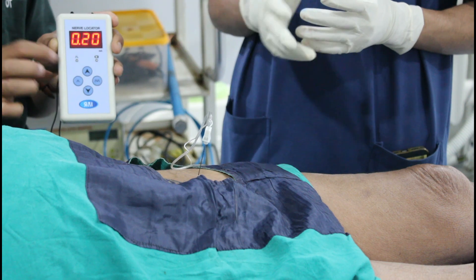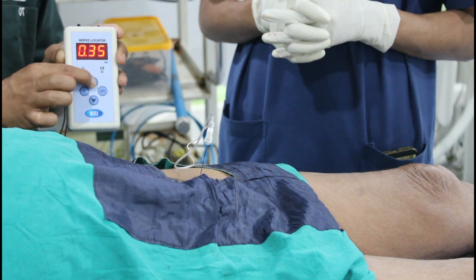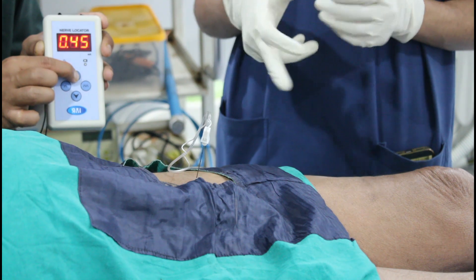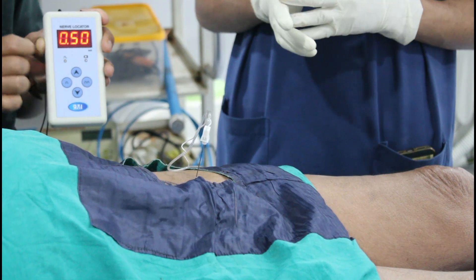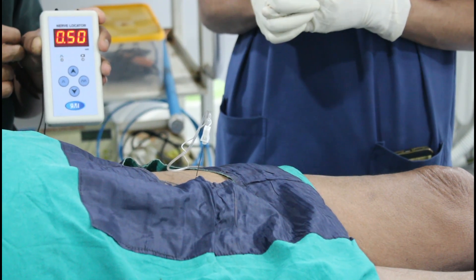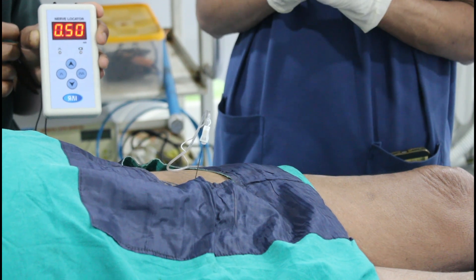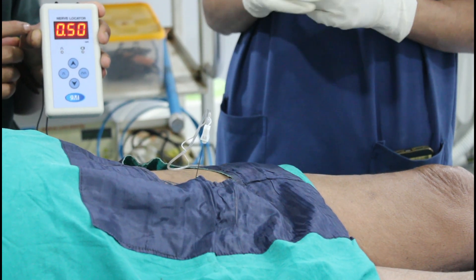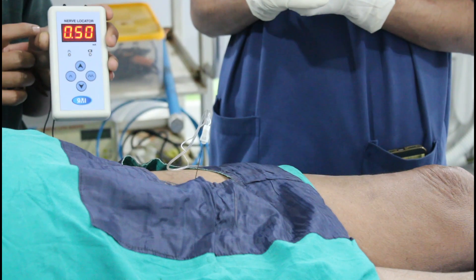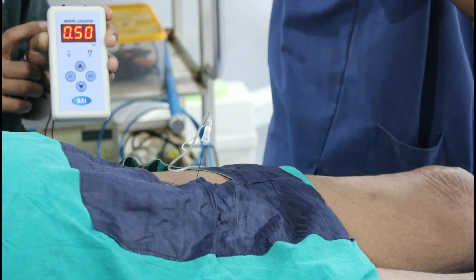So again we go back to 0.5mA current. At 0.45mA current my contraction again reappeared. That means my needle tip is exactly nearby to the obturator nerve. So now I will inject the local anesthetic mixture.